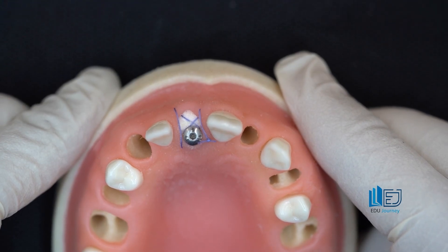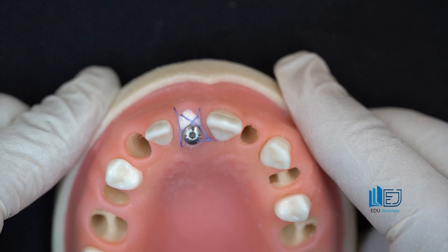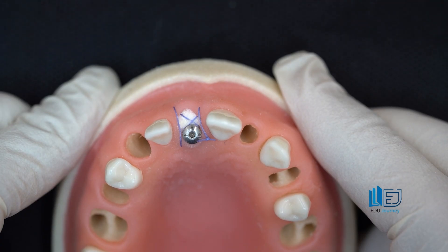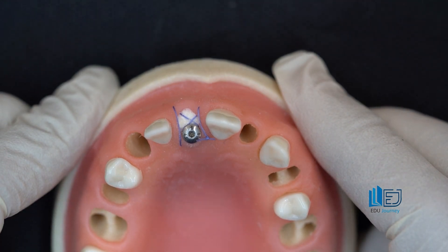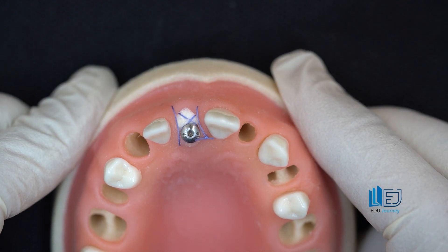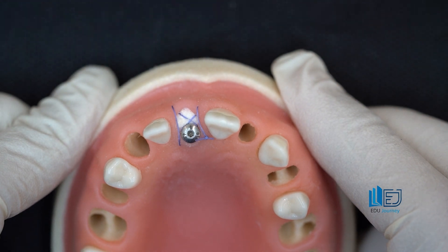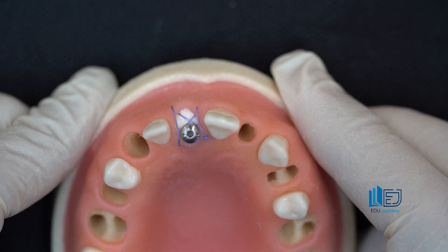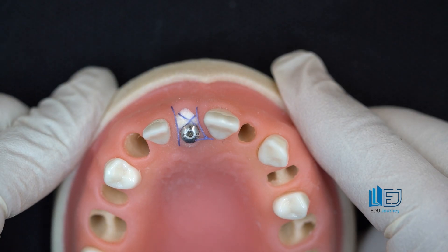To contain the bone material and prevent it from spilling out, I usually place a membrane, a dermis, or even a gel foam. Then, to keep the whole setup — the gel foam — fixed on top of the bone material and to make sure the clot stays in place, I usually use a figure-of-8 suture or a modified figure-of-8 suture. This is the final view of a one-stage fresh socket surgery in the aesthetic zone: the healing abutment has been placed on the fixture, the bone graft has been placed in the buccal area, and a membrane or gel foam has been placed over it and fixed with a figure-of-8 suture so the bone graft doesn't spill out. We discharge the patient so that the healing and osseointegration period can be completed, and after four months the patient will be ready for impression taking.